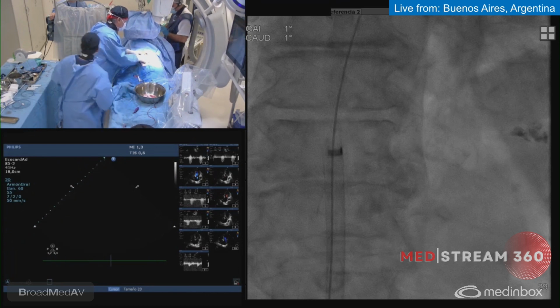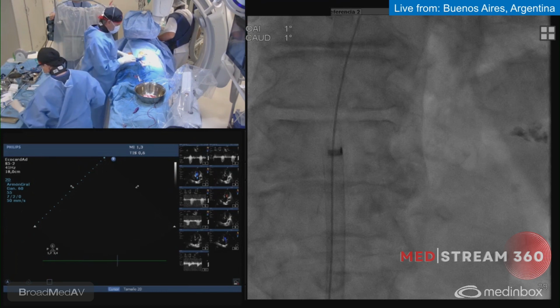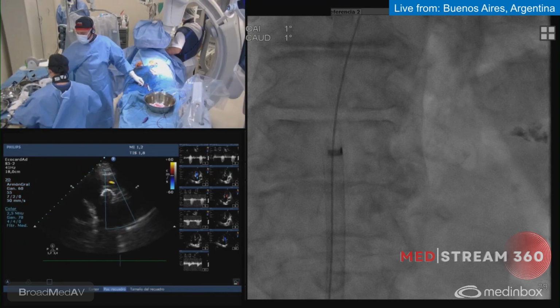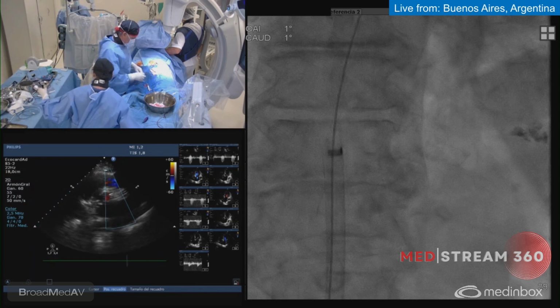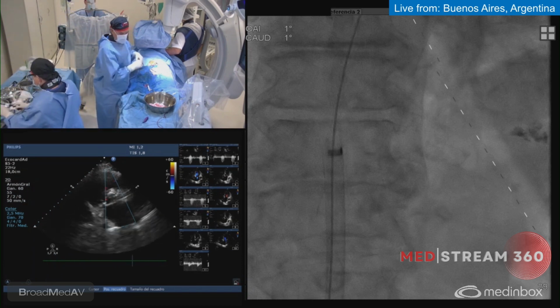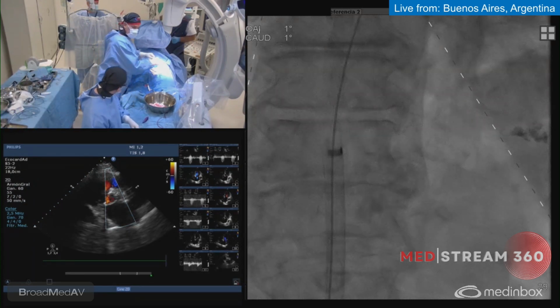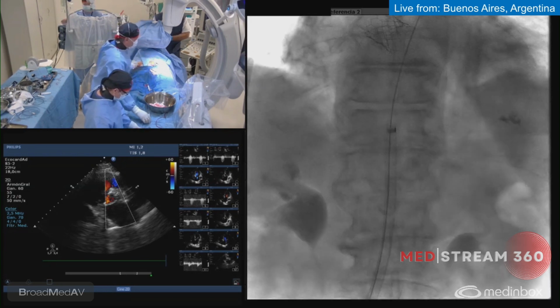Give me first the balloon. Yes, I will cross with the balloon just in case. Which is the reason why we're still using this? Well, because for sure, if you have a huge problem, it can be easily solved from the contralateral side. From a radial approach, sometimes you don't have the stents, or you don't have such a long balloon to cover. Surgery could be an option.